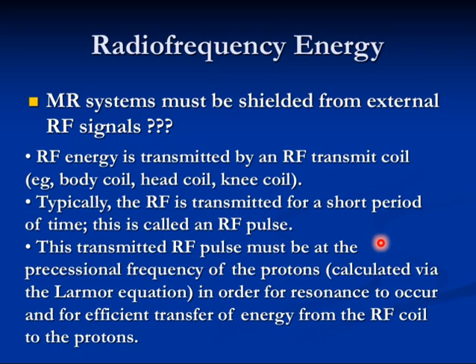You know, energy and matter cannot be created from nothing and do not go away, right? That's the Einstein principle. So when you give an RF pulse, you receive an RF pulse. The machine gives one, the brain sends it back. So how do we detect the one that's coming back? By the surface coil. It's just an antenna, a powerful, very sensitive antenna. Now, we send the signal at the Larmor frequency, the resonant frequency, for efficient transfer of energy. The protons in the patient's body will receive it. What will happen?